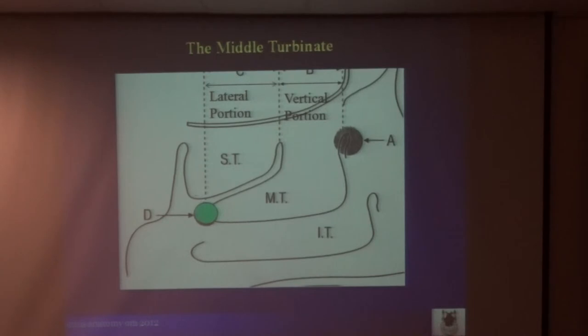If I see them banging on it, destroying it, causing it to bleed and not respecting it, I know that very soon I'm going to take over the scope and continue the surgery. But if they show much respect to this part, I know that the rest of the surgery will go very smoothly. So this is an early hint of how the rest of the procedure is going to be: showing respect to the middle turbinate, especially the anterior part.